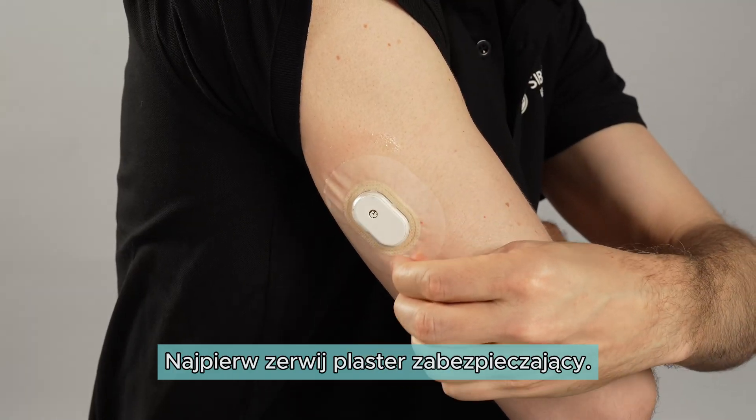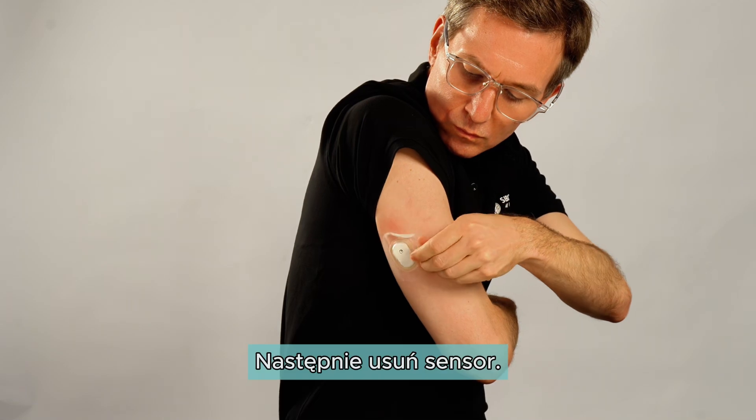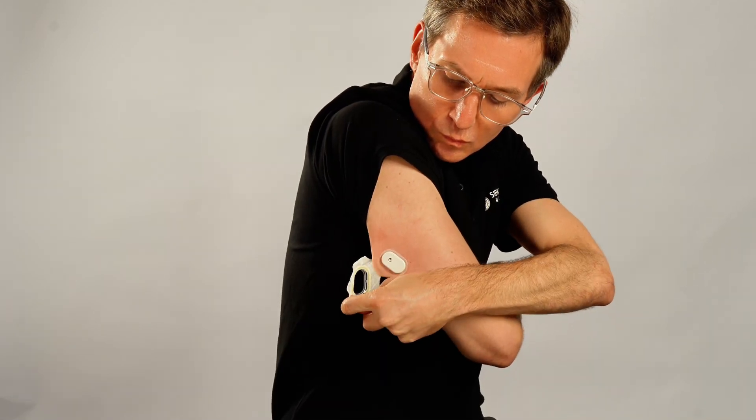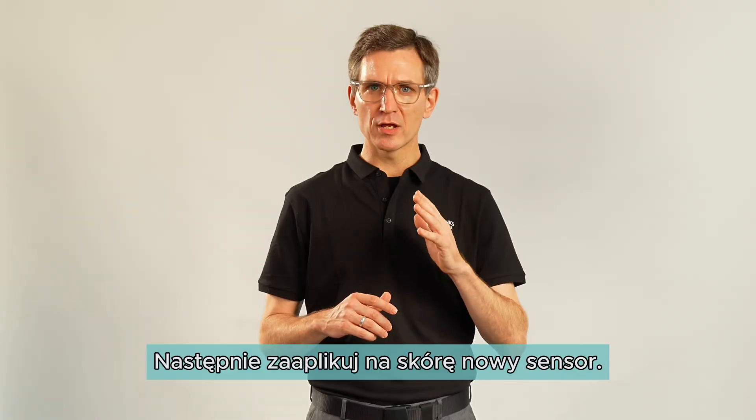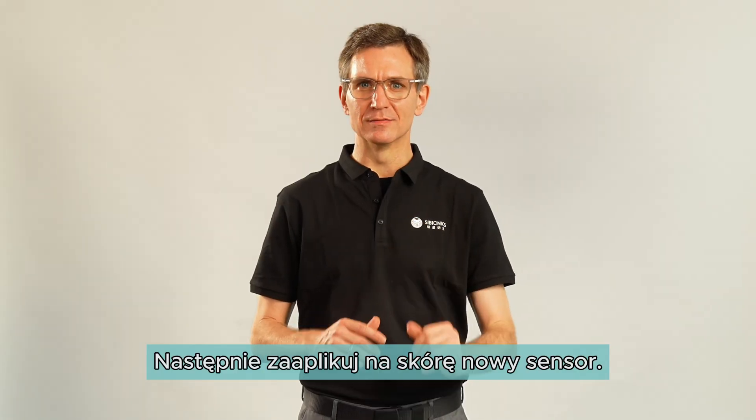First, peel the overpatch off from the sensor. Then remove the sensor. You should dispose of the used overpatch and sensor properly. Finally, apply your new sensor as needed. That's it.